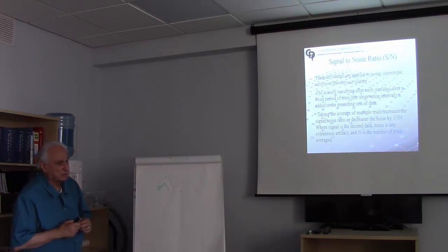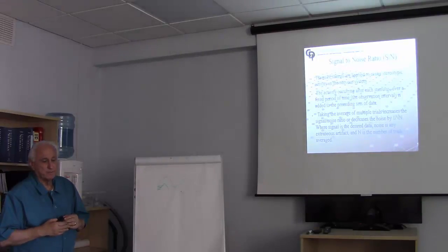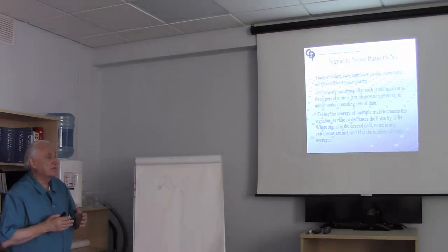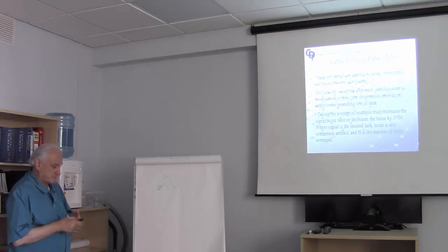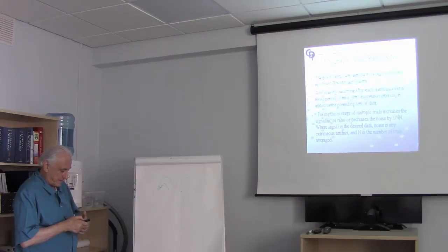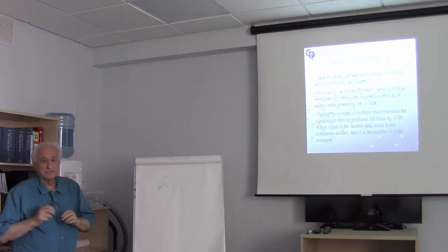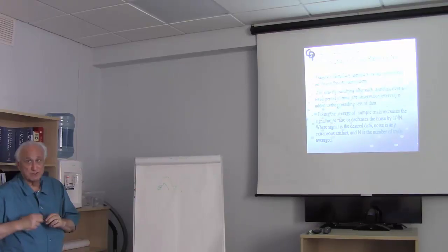So we want to start to talk about extracting the evoked potentials from the background noise. So you're going to try to record an evoked potential from an ongoing EEG. To do this, trains of stimuli are applied to evoke stereotypic activity. And I emphasize the word stereotypic. The reason these evoked potentials are useful is that if you set things up the same way every time, you're going to get essentially the same response every time in a normal person.